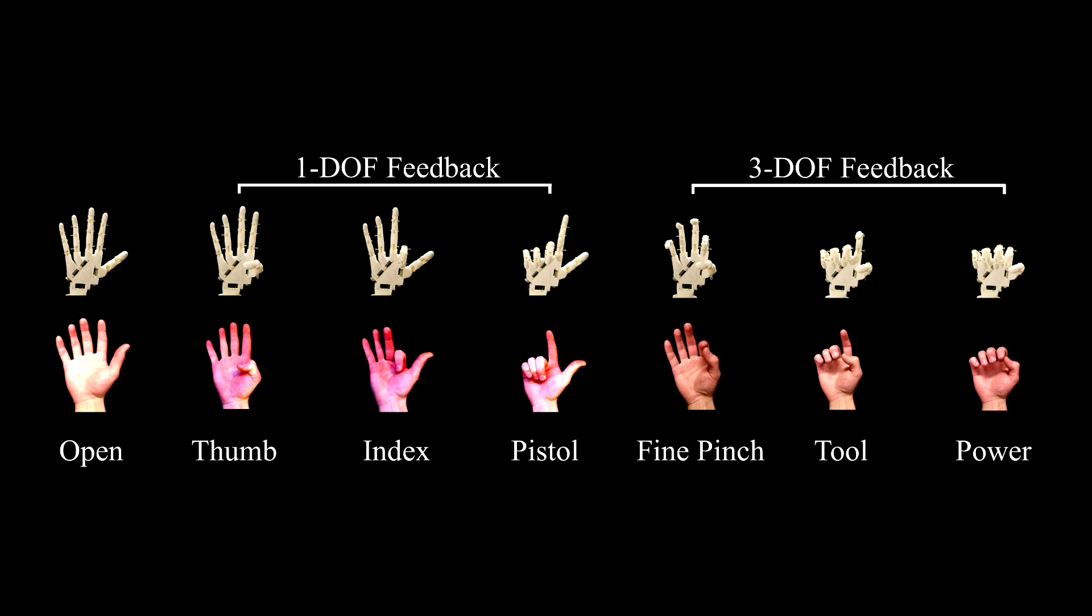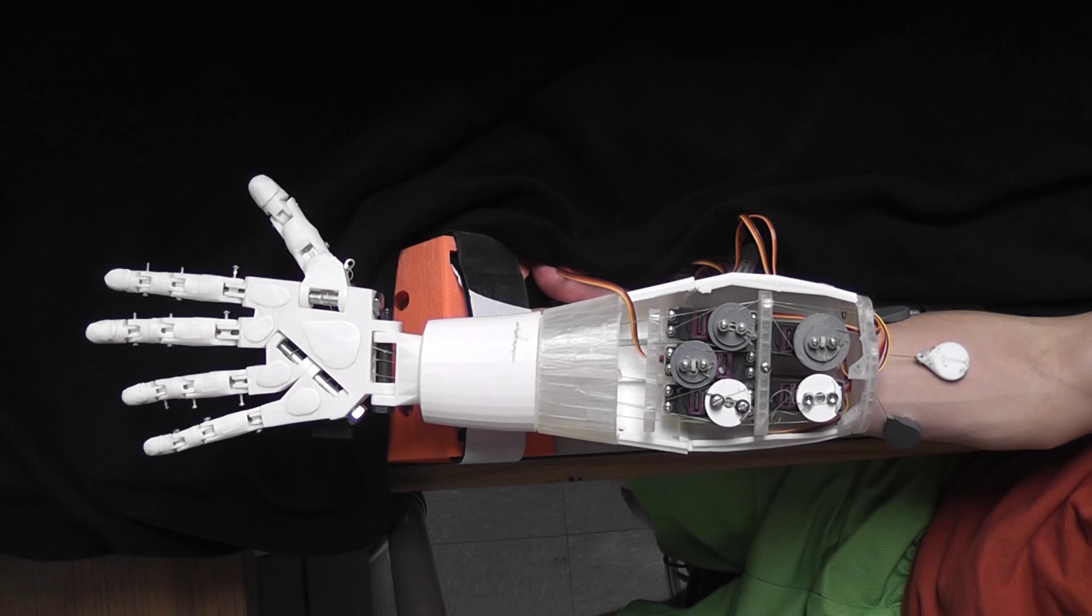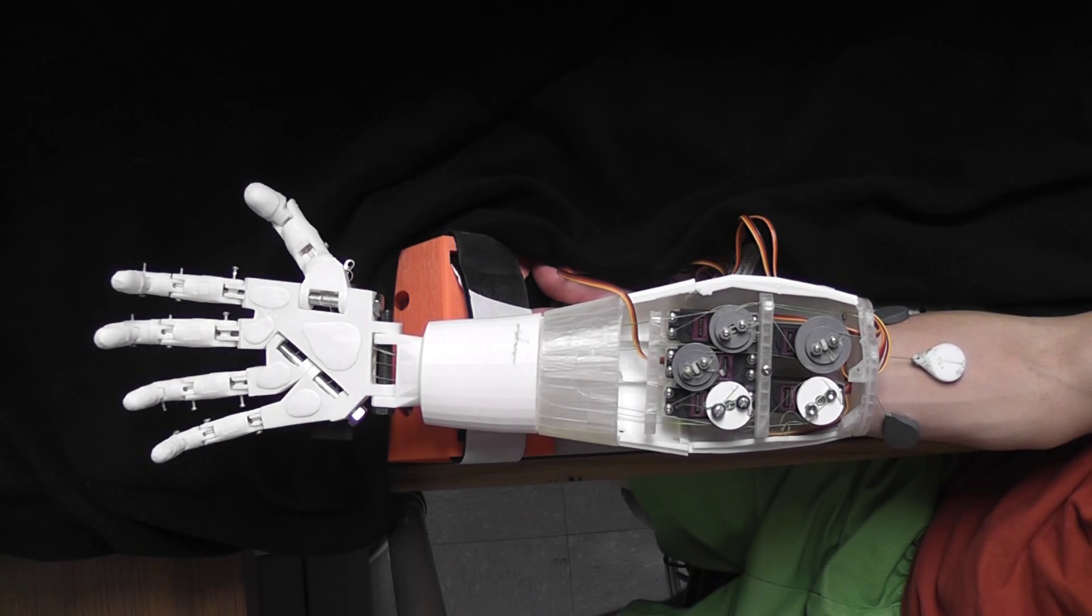Subjects were asked to distinguish between six grips, all beginning from an open hand configuration. Here, you can see how multiple contact pads are displaced for particular grips.